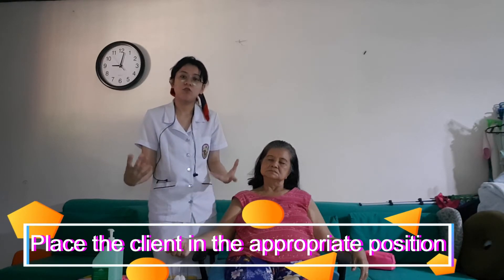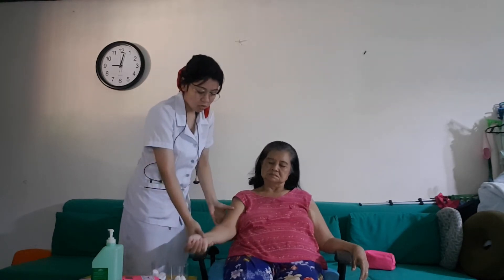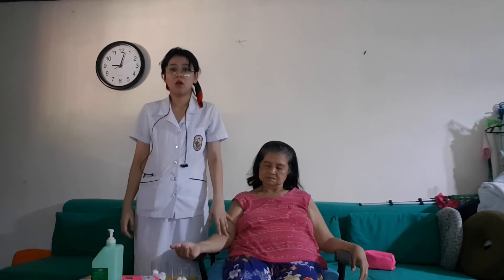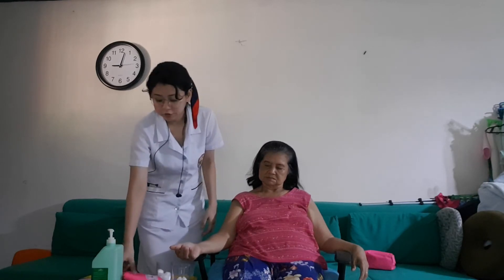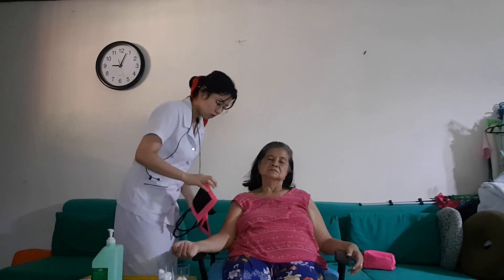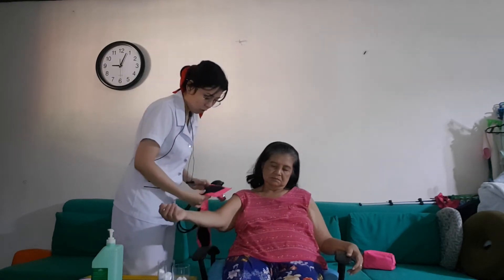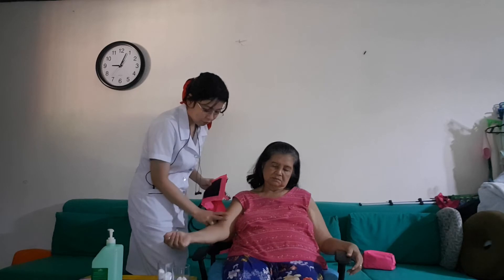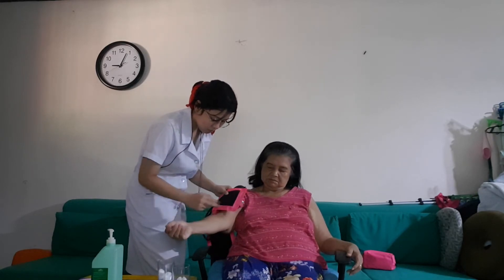Next, we have to place the client in an appropriate position — sitting position, feet flat on the ground, elbow slightly flexed, and the palm facing up. Next, we have to place the deflated cuff, locate the brachial artery, and apply the center of the bladder directly over the artery. For adults, place it 2.5 cm or 1 inch above the antecubital space. This is the antecubital space, so the cuff goes just above it, with the arm slightly flexed.